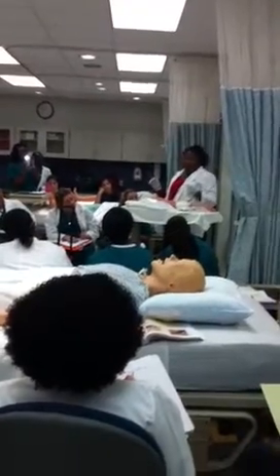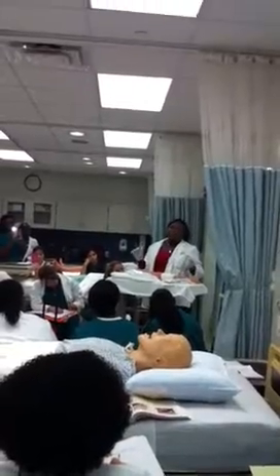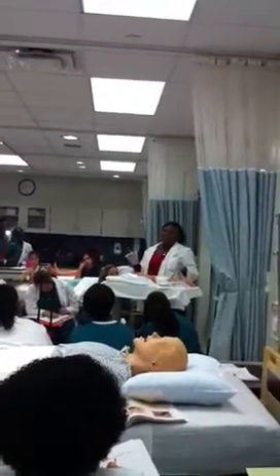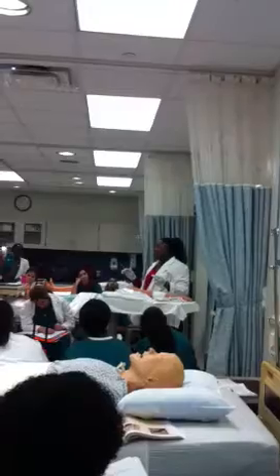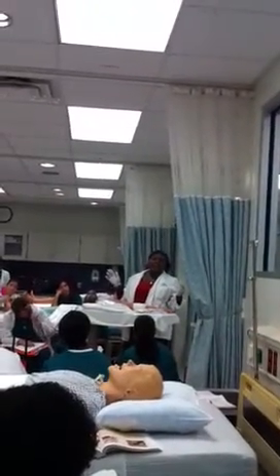Some hospitals follow policy and procedure that needs two nurses to check insulin. Follow your policy and procedure. Two nurses to check insulin. Does anybody notice how I'm holding my syringe? Away.